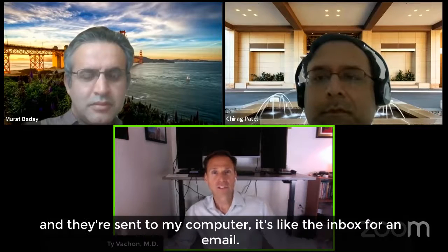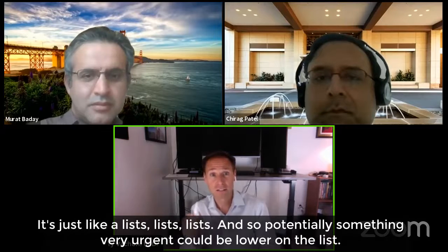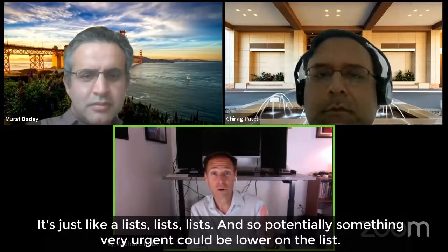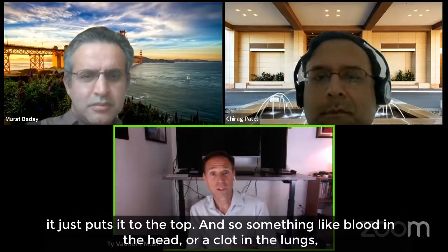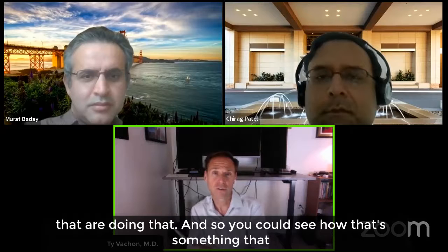And then if I could just add one more: when CAT scans and MRIs and X-rays are all done and they're sent to my computer, it's like the inbox for an email. It's just like a list. And so potentially something very urgent could be lower on the list. And so there are AI algorithms that scrub that list, and if it's something worrisome, it puts it to the top. Something like blood in the head or a clot in the lungs would be bubbled to the top, and there are specific vendors that are doing that.